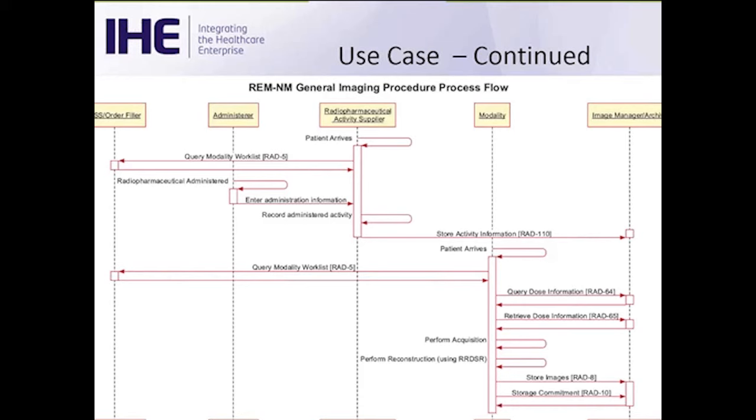Then they can now perform the study, and they can reconstruct and then store the images back to the image archive. The image archive would have the dose report, what was happening when the activity was administered to the patient, and the images are all in the same study set in the image archive. So I think that finishes this slide, Jeff.